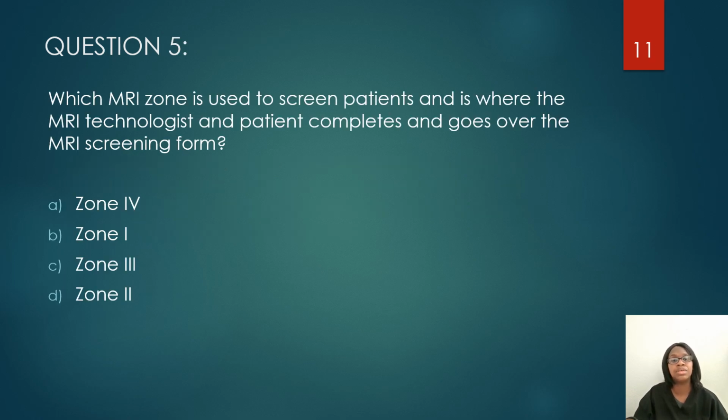Which MRI zone is used to screen patients and is where the MRI technologist and patient complete and go over the MRI screening form? Zone 4, Zone 1, Zone 3, or Zone 2?